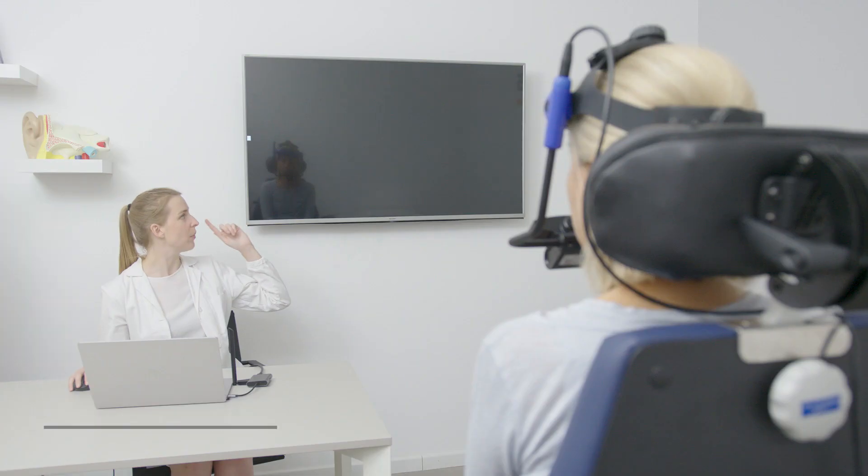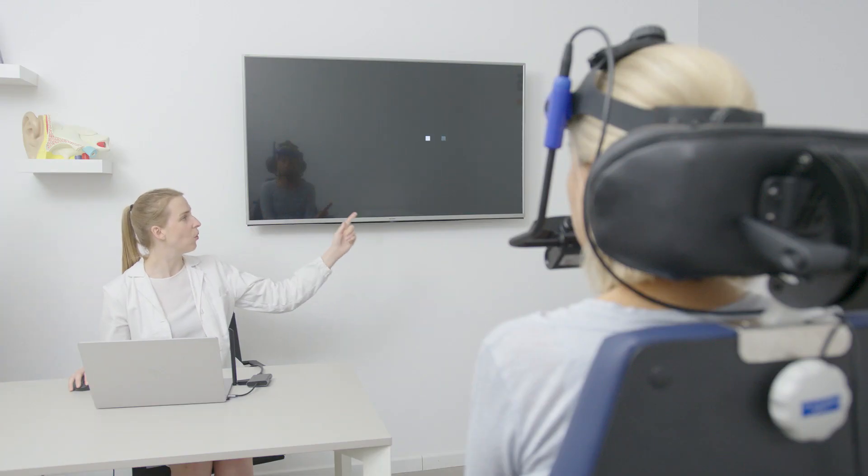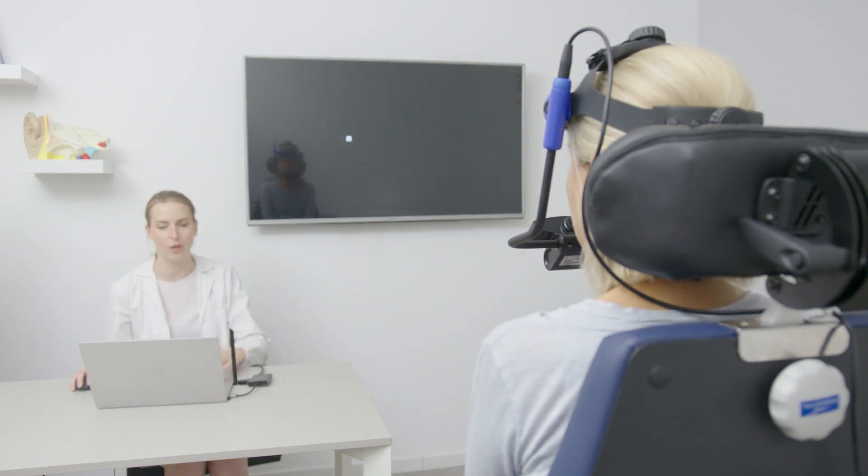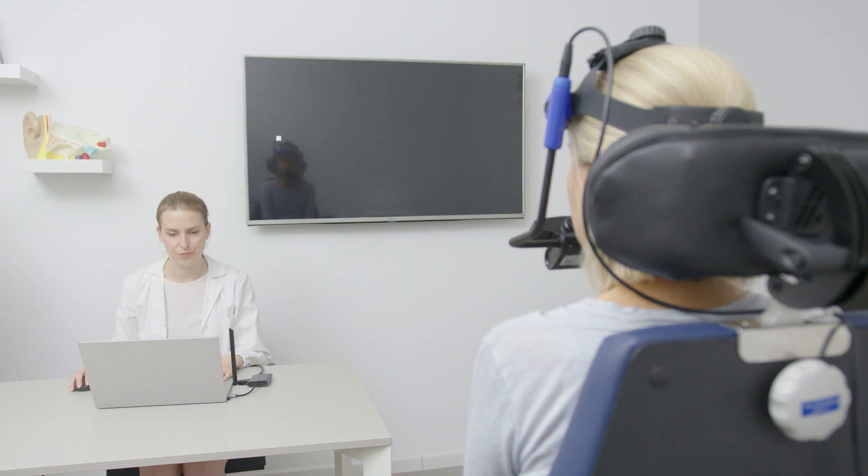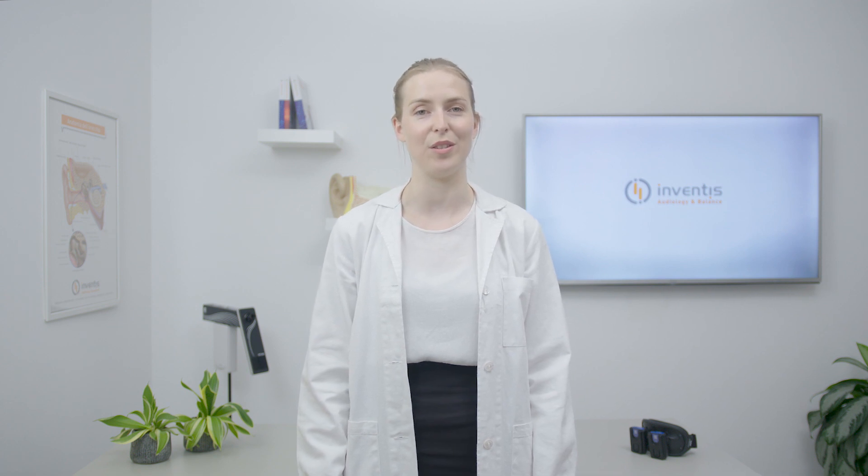The smooth pursuit test consists of eight different examinations that are classified based on direction and speed. The software provides a convenient feature for clinicians to customize settings directly enabling them to adjust directions, amplitudes and frequencies according to their specific preferences.